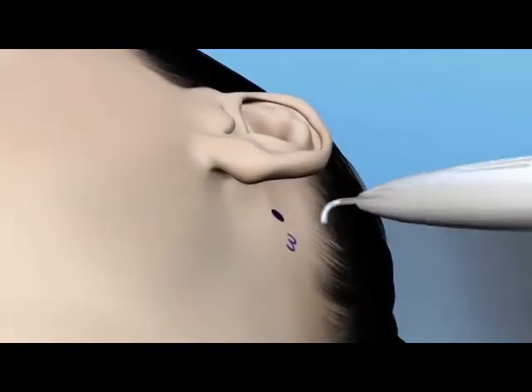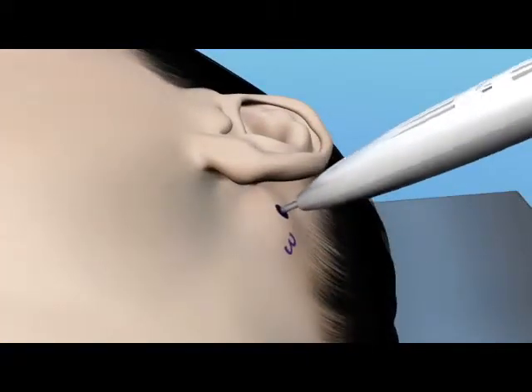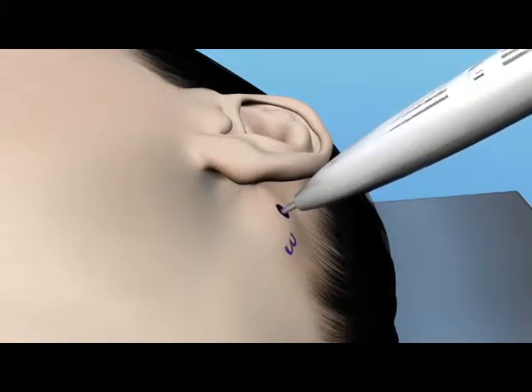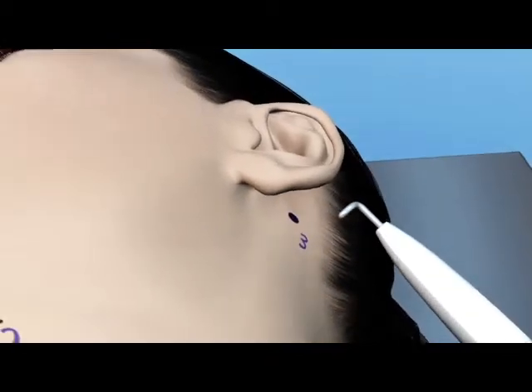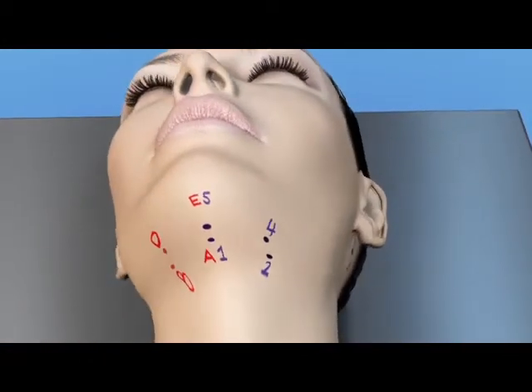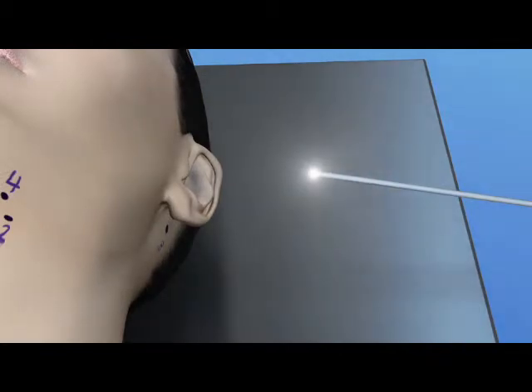The neck-defining suture that is placed here works very effectively to elevate the structures and skin at the posterior aspect of the neck. This includes the submandibular glands and underlying soft tissue, as well as the cervical mental angle, as well as the areas around the angle of the mandible, which will help define the jawline.